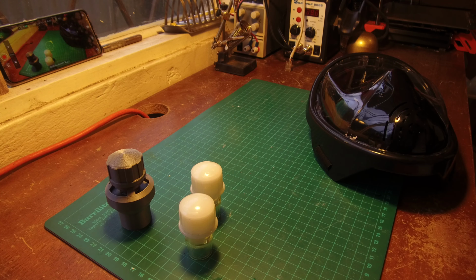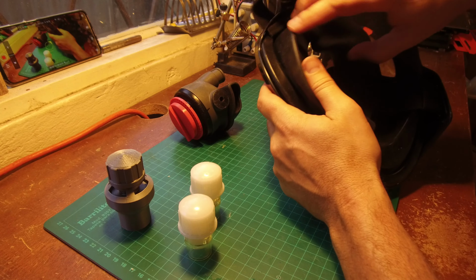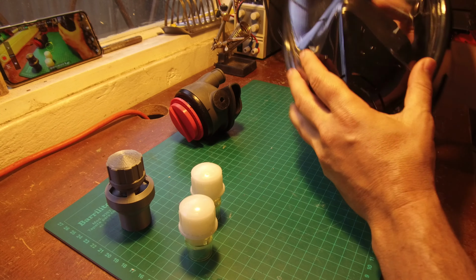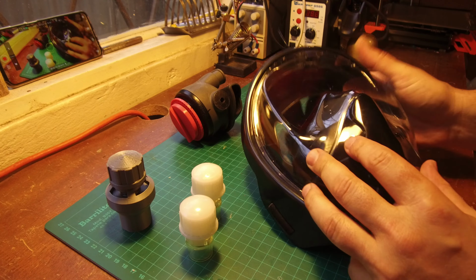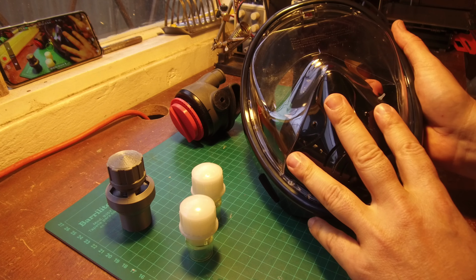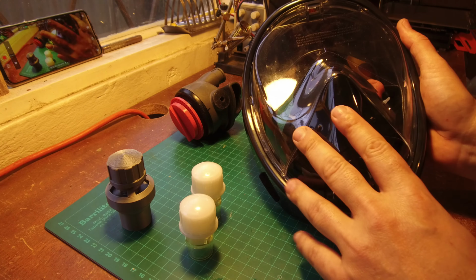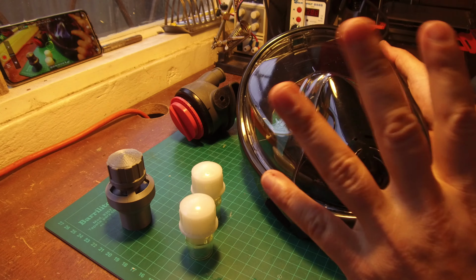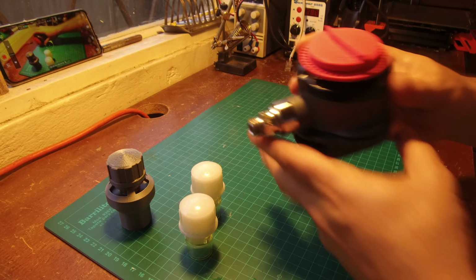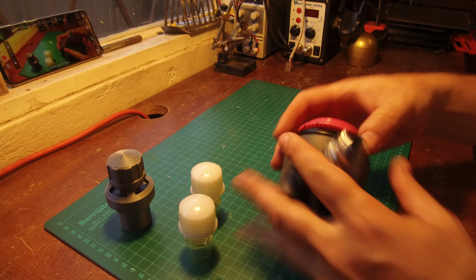So basically, the full face snorkeling mask, you need to have a full seal on the airways. Mouth and nose need to be covered up. Anything similar might also work. You might find this at a kids store, toys and stuff like that, or sports stores might have this one.